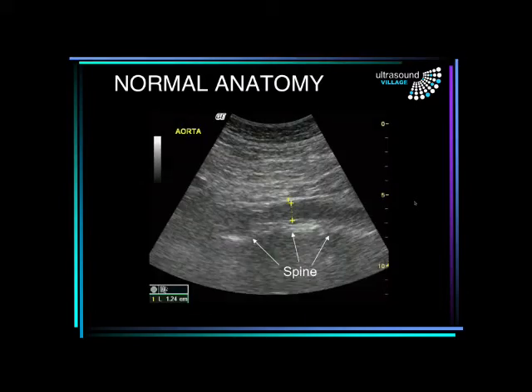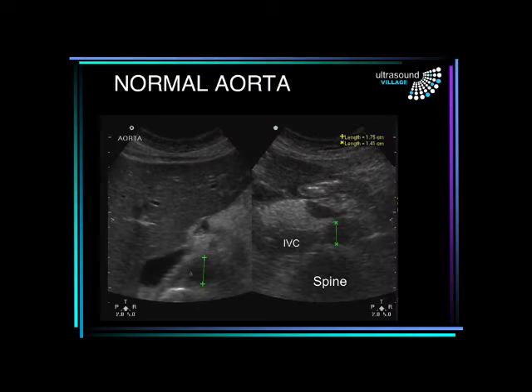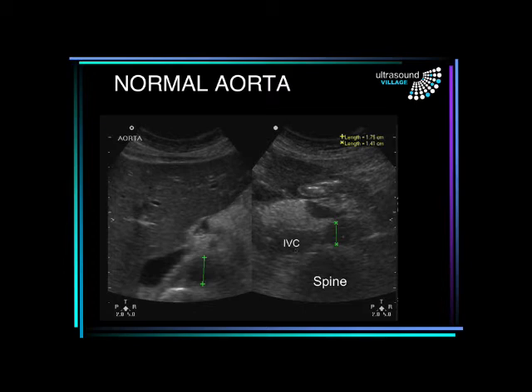This tends to be what you see more often in a patient of more usual size. Here the aorta is a lot deeper. We see the bright scalloped edges of the spine and a long tubular structure lying over the top. In the transverse view, we normally take a picture proximally — here we can see the aorta, the IVC, the front of the vertebral body, and the liver. As we come further down, here again we have the IVC, the aorta, and the spine. We would take a measurement just above the bifurcation, showing that we've scanned the entire length of the aorta.